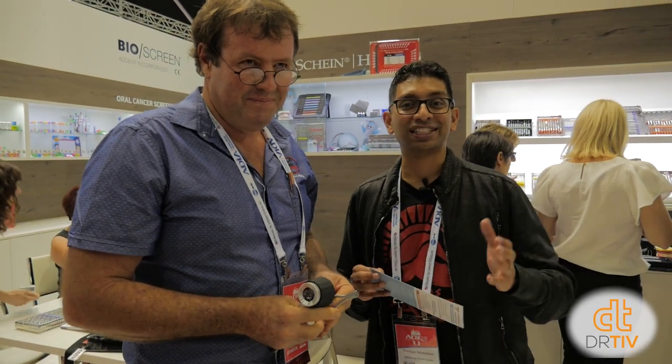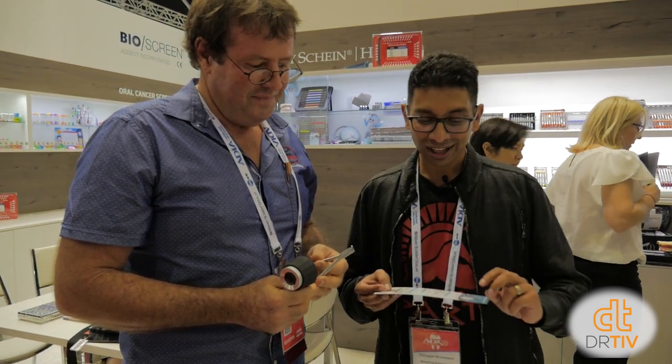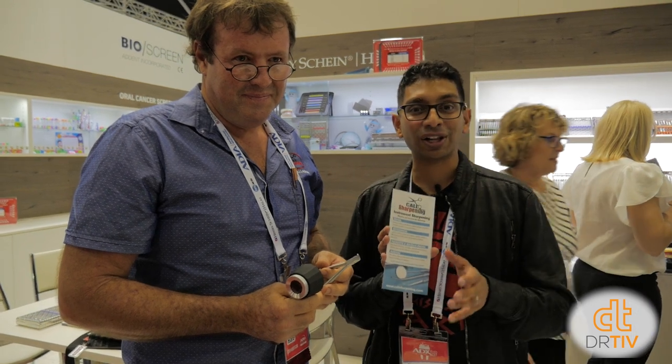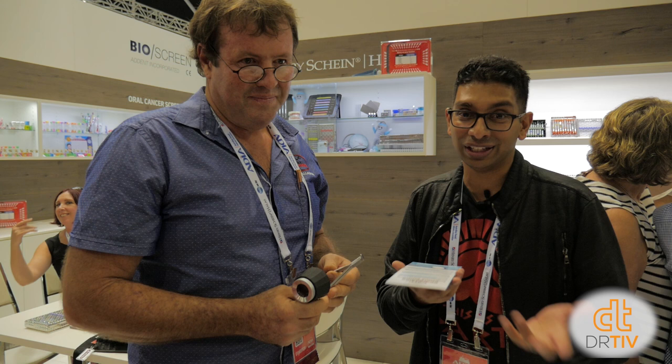This is Sharpening Bob. We all have instruments that are blunt that we can't use — scissors that don't cut, end cutters that don't cut, things that don't do their job. Sharpening Bob will sharpen instruments for somewhere between five to twelve dollars, with a turnaround of only three to five days depending on what you need sharpened.